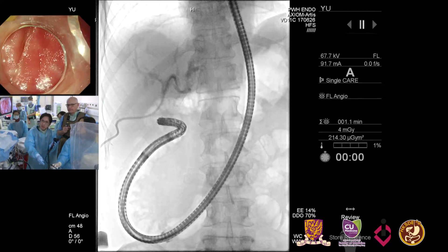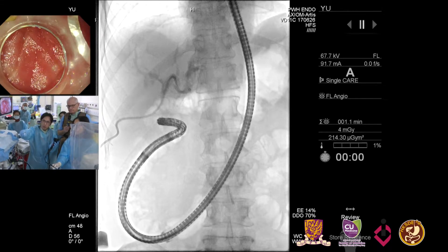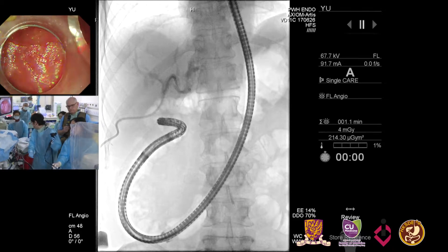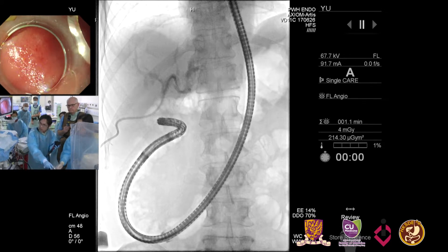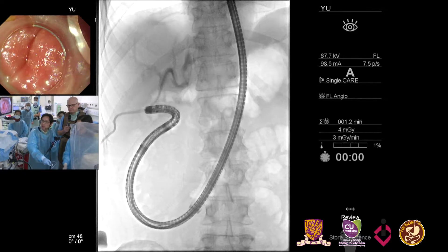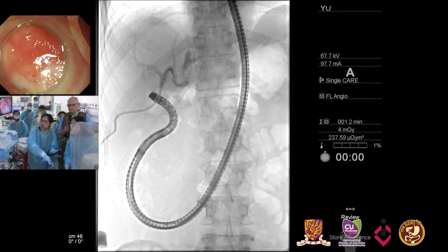The balloon overtube is already in the small bowel. The balloon is up and I'm going to do a little scope reduction here, pulling back. You can see the balloon on the overtube on the X-ray. Now I'm trying to straighten the scope.